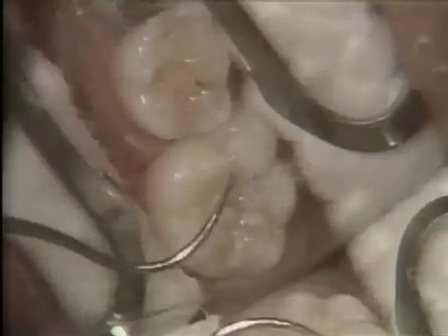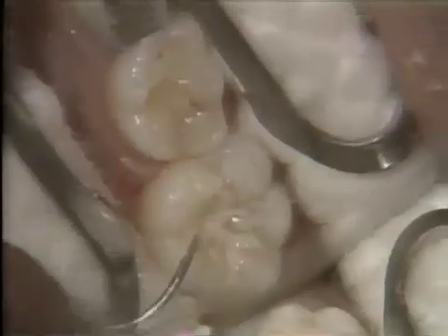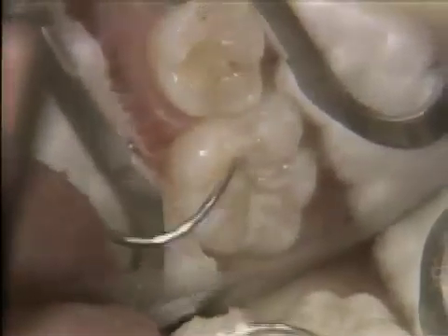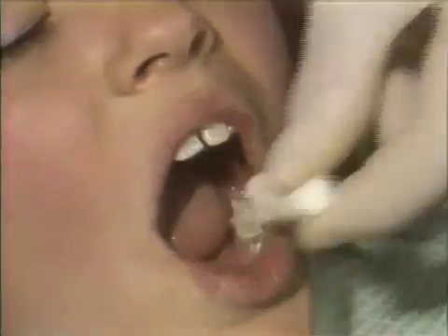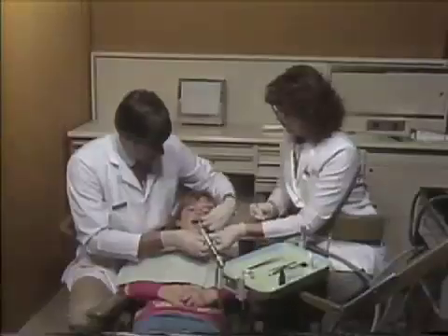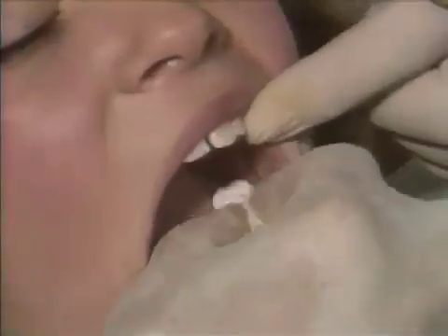The sealant is evaluated for air bubbles and incomplete coverage of pits and fissures by moving the explorer from the tooth to the sealant. More sealant can be applied at this point if no contamination has occurred. The isolation materials can then be removed. A thin film of unpolymerized sealant will remain on the tooth and should be wiped off with a cotton roll, since the film has an unpleasant taste.